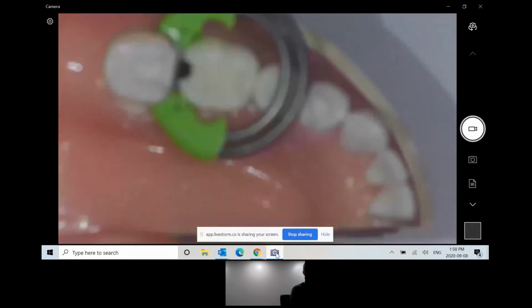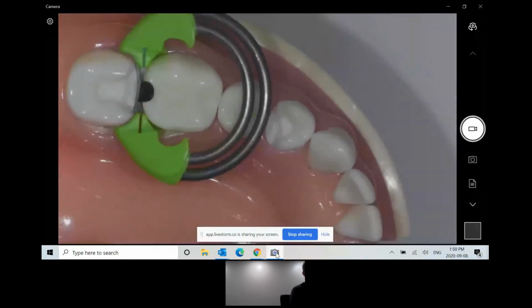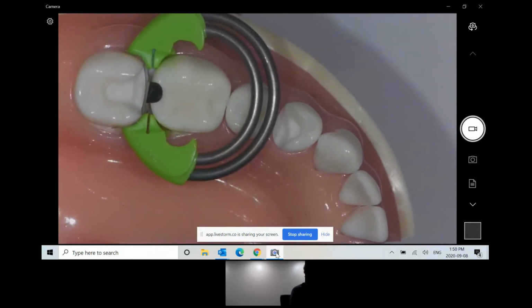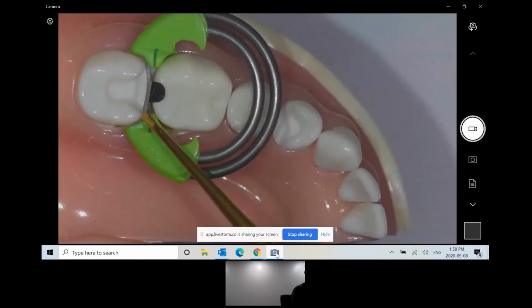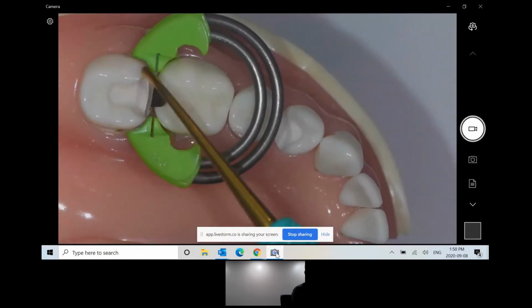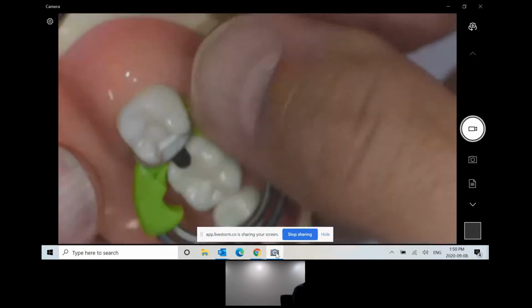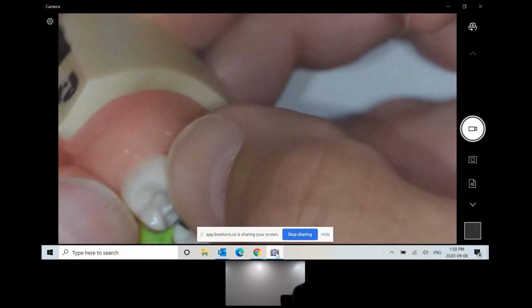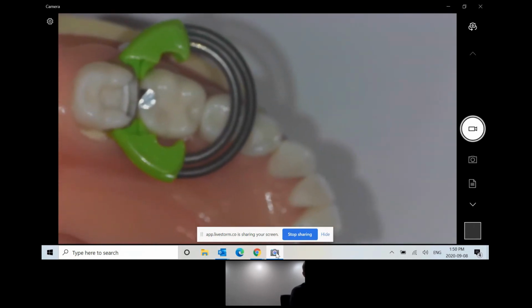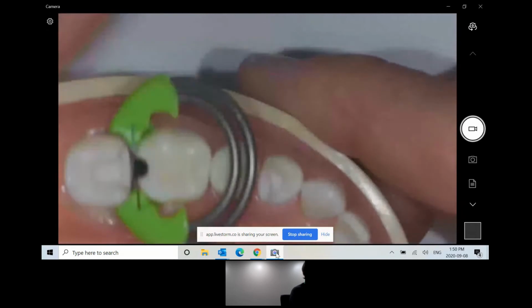But you can see here, let's refocus this for you, there's virtually no need to burnish that band, and how well it is sealing past or beyond the proximal line angles of the restoration. Okay, I know this is on a model, so I don't have a periodontal ligament that's going to give me a little bit more flexibility of movement, if you will.